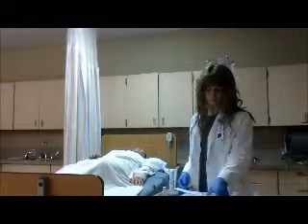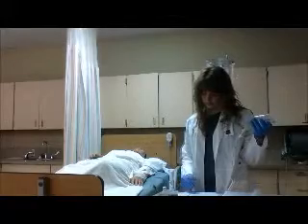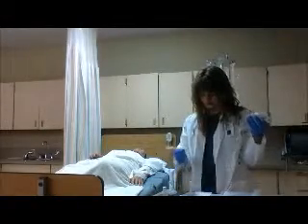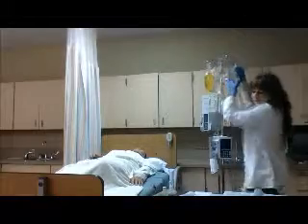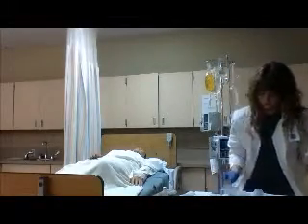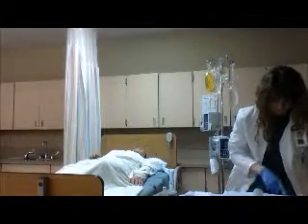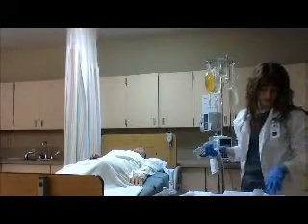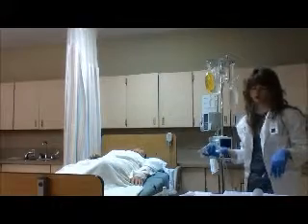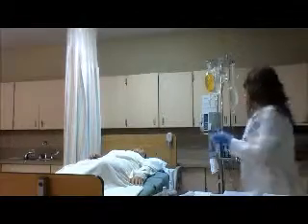So now I can take my infusion, and I'm going to be looking at my math, and I know I need 20 milliliters over 1 hour. And also with heparin, I've read in my MAR, or my drug guide handbook, that we need to invert our container a minimum of 6 times to ensure adequate mixing of heparin with solution. So I'm going to invert this 6 times.